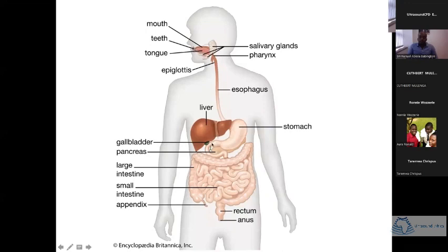We then continue here: the first part of the duodenum, second part of the duodenum, third part of the duodenum, and then you start the jejunum from about there. So you have mostly the jejunum, then the ileum. So you can see why it can't be examined in its entirety, because the small intestine is all very interwoven. But the bowel ultrasound still does a really good job at examining the small bowel.